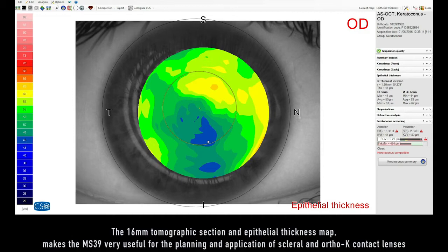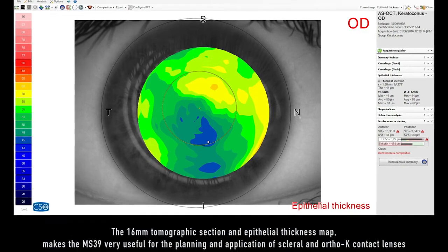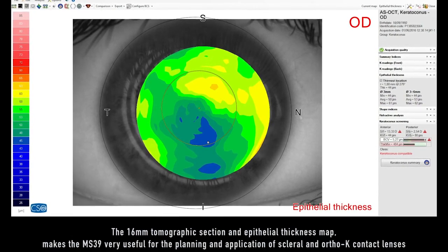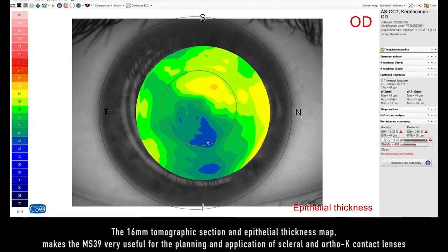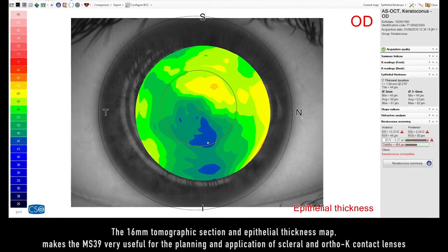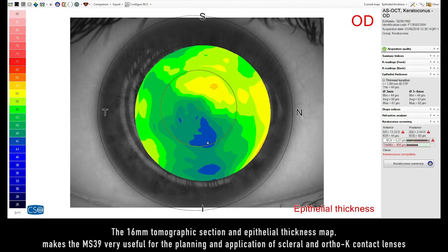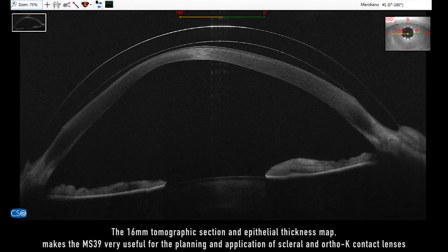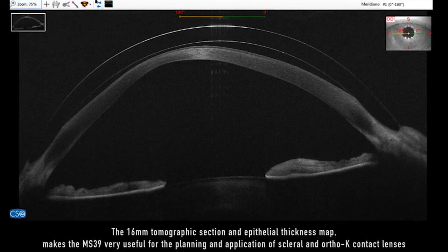The 16mm tomographic section and epithelial thickness map makes the MS-39 very useful for the planning and application of scleral and ortho-K contact lenses.